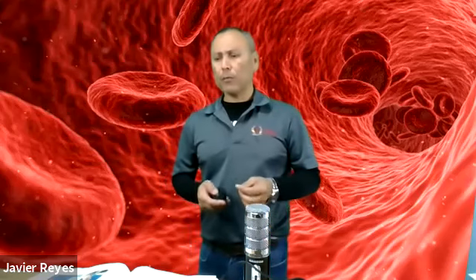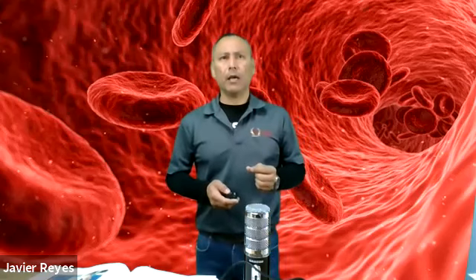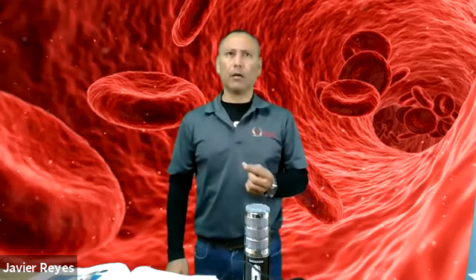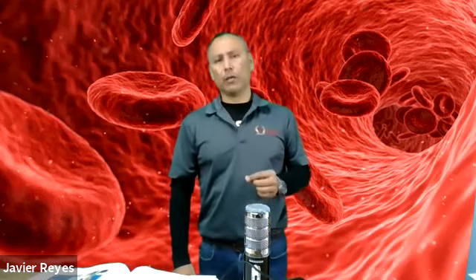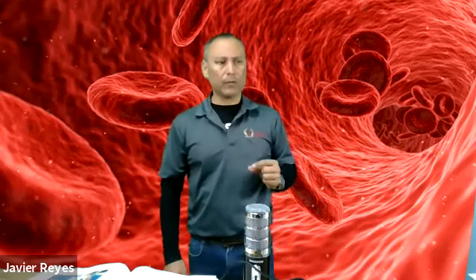Now, once you perform your lancet puncture, you will be collecting specimens in micro collection containers. These are very small plastic containers that have a limited amount of space for blood, used to collect very small amounts from capillary punctures. Some come with narrow capillary tubes attached, such as the purple ones we've seen here.